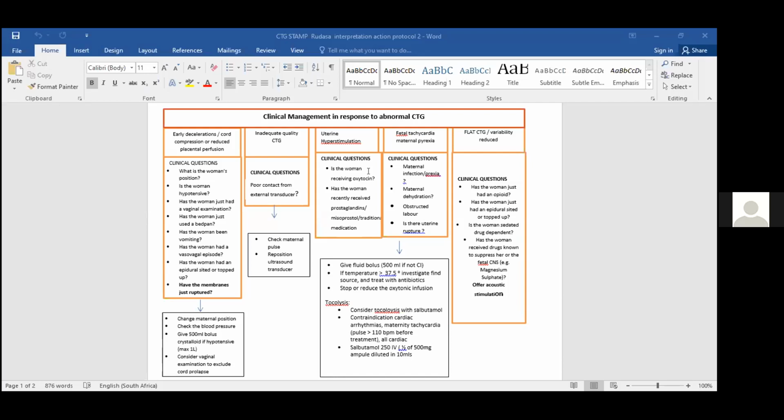And then the other things we discussed, especially with fetal tachycardia: doctors do not come out to see patients with CTGs that have a fetal tachy. The most frequent response is, oh, just give her ceftriaxone and flagyl and just repeat the CTG in 2 hours.